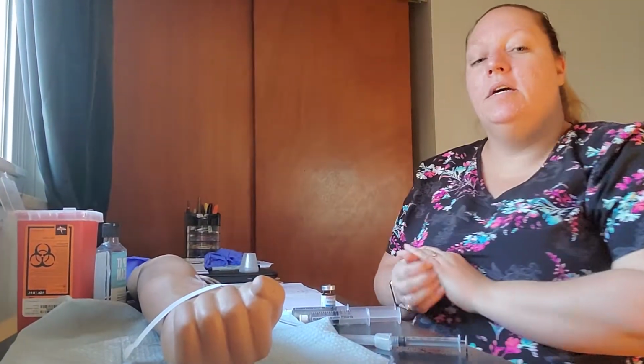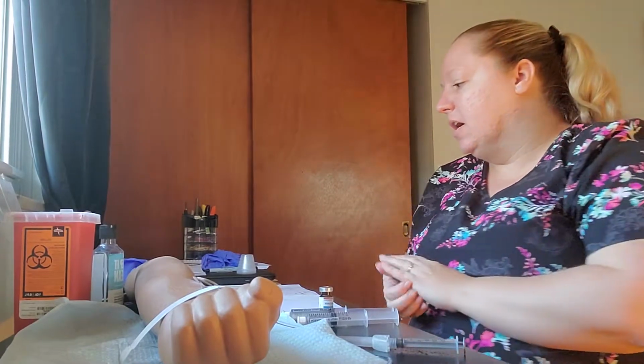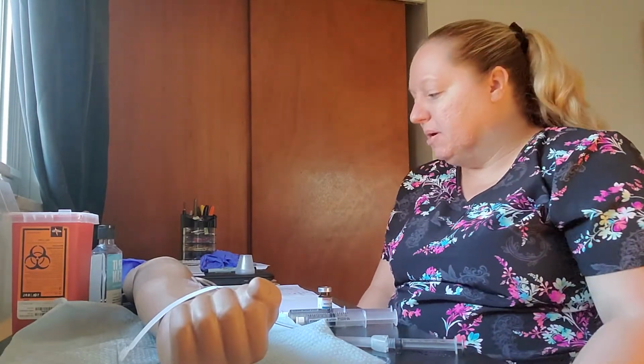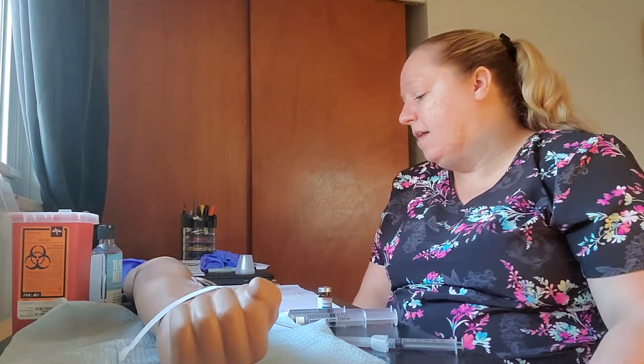Hi, my name is Tracy, and I'm the nurse that's going to be taking care of Miss Mary Edwards. Miss Mary Edwards was admitted to our facility for fluid overload. She is a patient of Dr. Smeltzer's. Dr. Smeltzer has ordered today for her to have bumetanide 0.5 milligrams IV push over 60 seconds.